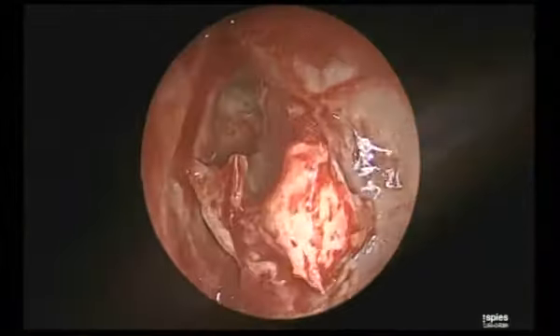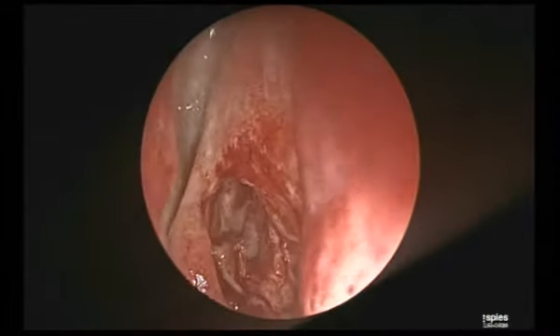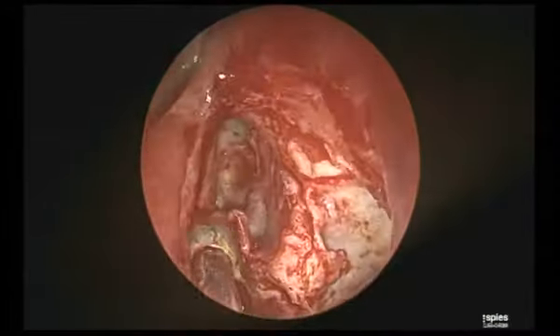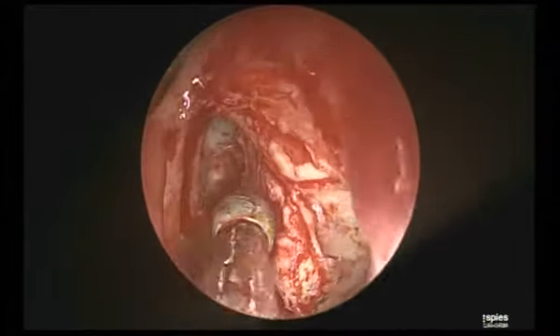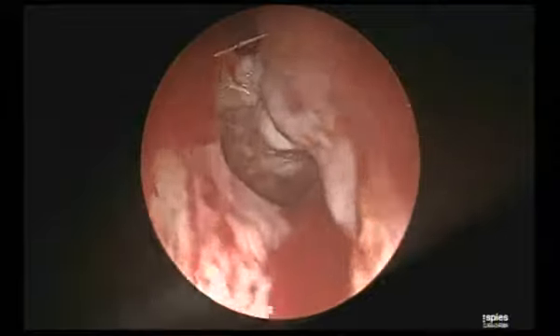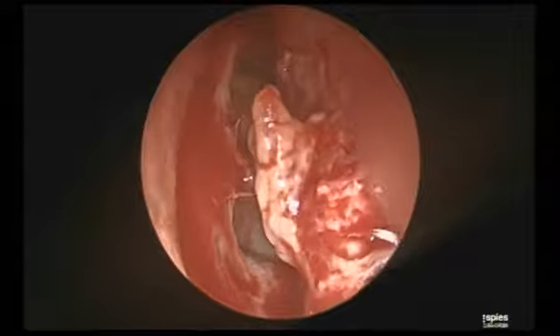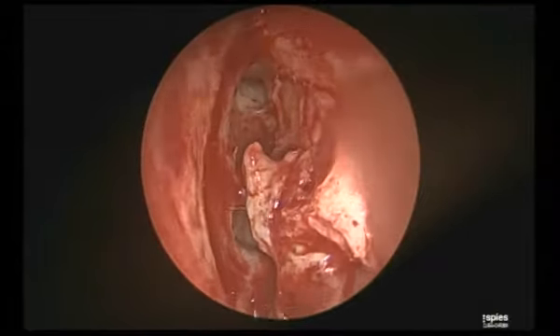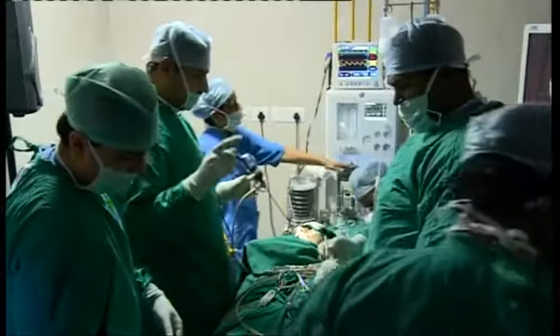And now that he has seen that artery there with the bulla there, now the bulla, theoretically we call it the garbage. Now obviously it has to be removed, whichever way you want it. Now, Ashish, another thing which I mentioned in the beginning. See where the bulla gets attached to the skull base, high up. Can you see? Debride a little bit of this, we'll be able to see it better. Yes, your point is good.